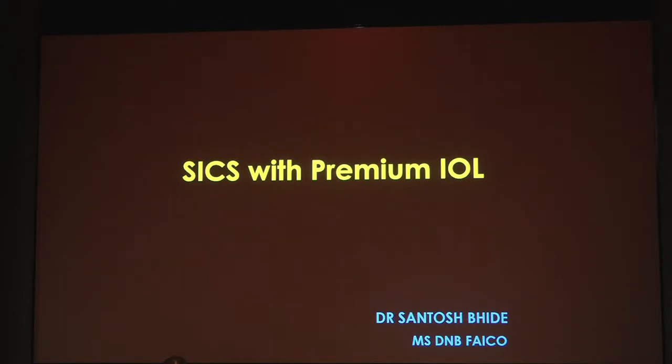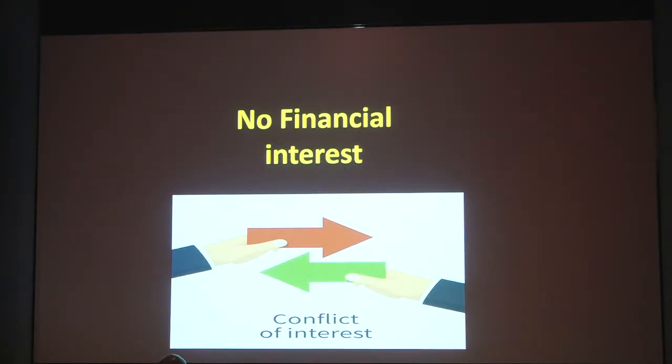So I'm going to talk on SICS with premium IOL. I do not have any financial interest in any of the products mentioned in this talk.